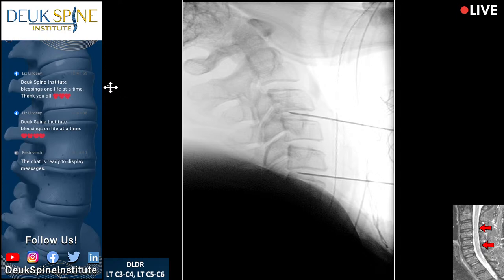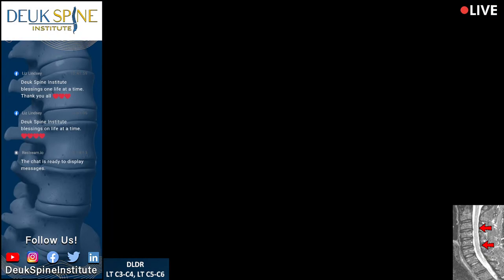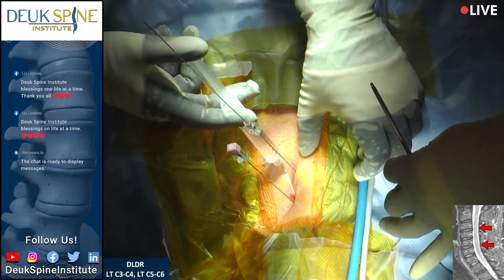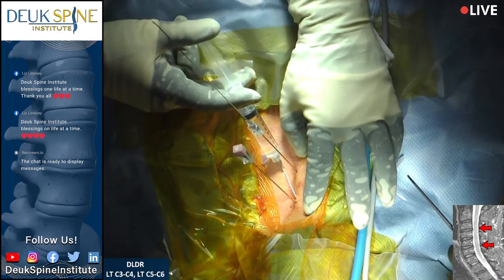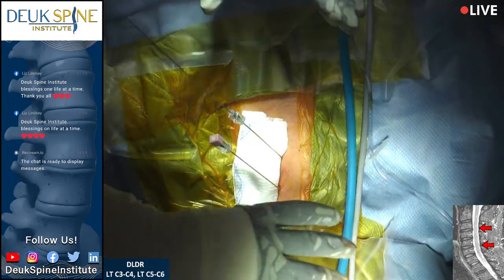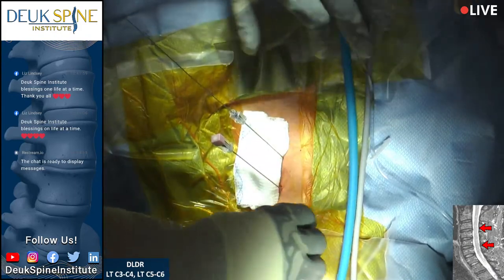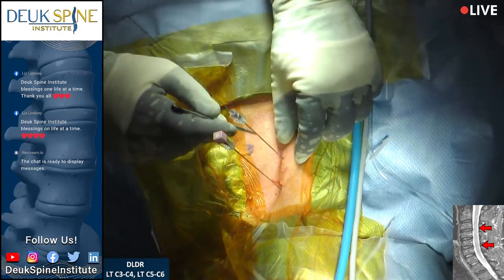I'm going to put a little numbing medicine in the skin before we make our incision. The incisions will be 4 millimeters. We're injecting local anesthetic. So far our patient is doing great. The face is here, the chest is here — this is the neck — and we're going in on the left side with two small 4-millimeter incisions.